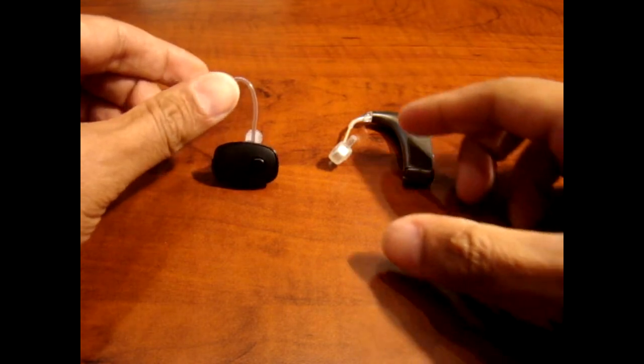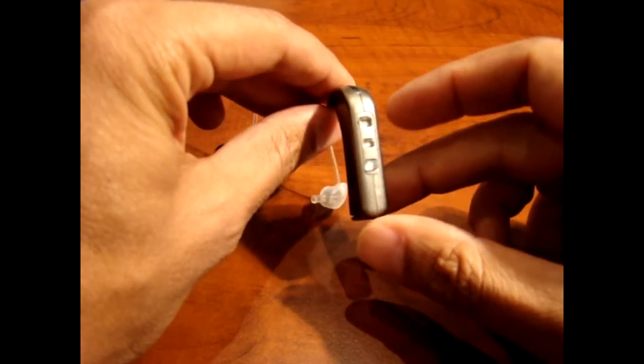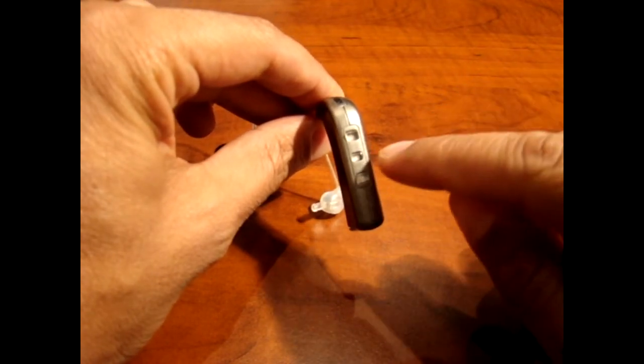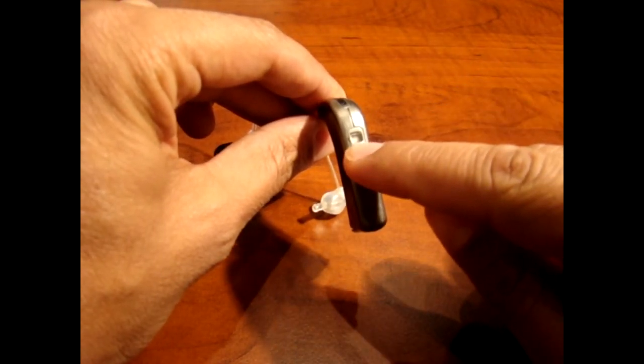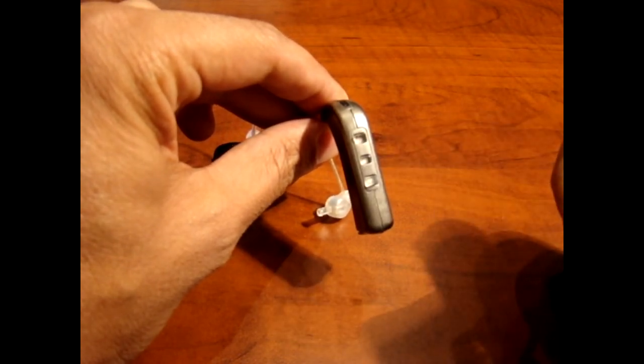For the HD100 device, to answer the call and end the call, you press the middle button. It will answer it, and once you're done, just press it again and it will end the call.